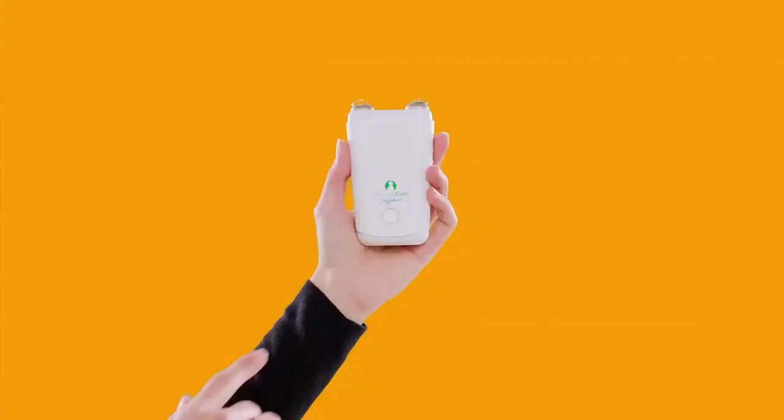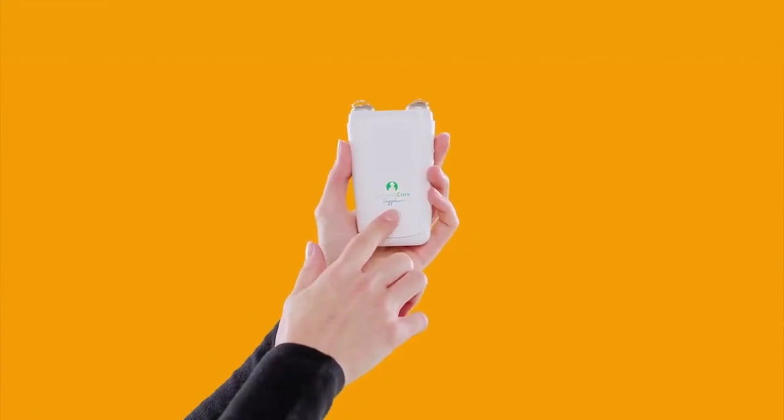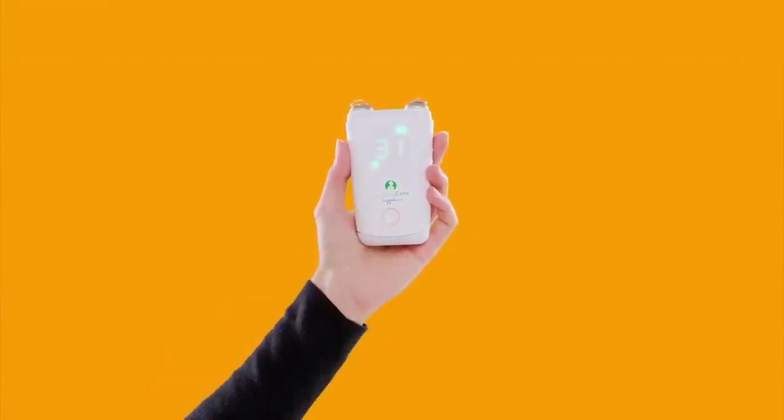Now turn GammaCore on using the power button and wait for the device to beep once. Position the device on your neck as you practiced earlier. Both stimulation surfaces must be making complete contact with your skin for GammaCore to effectively stimulate your vagus nerve.